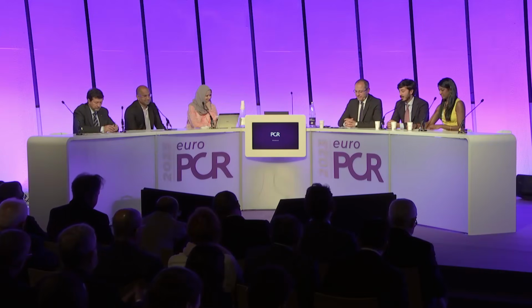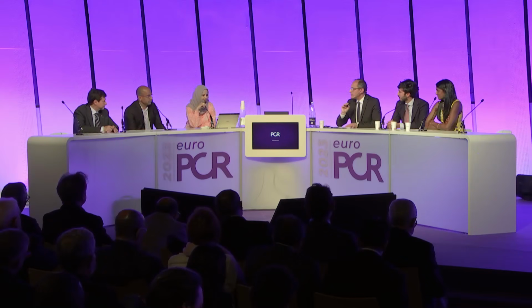I've always done this, and I think that if you reduce a little bit the speed of the rotablator, maybe you can have a little bit more the risk of rupture of the vessel, and sometimes you can also have the risk of burr entrapment. I prefer to have higher speeds during these runs. Let's hear if there are comments regarding the technique of rotational atherectomy from the several colleagues.